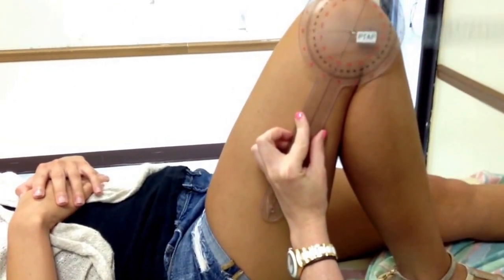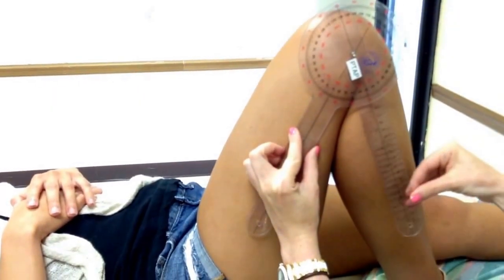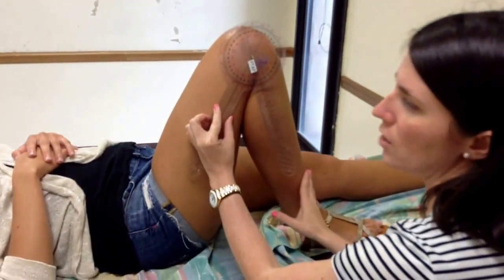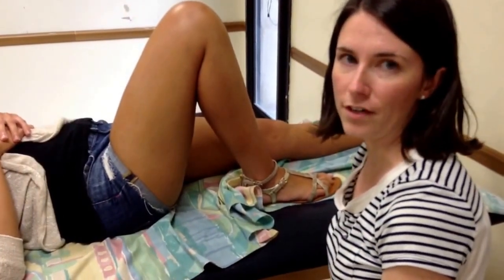Technically she started with full knee extension, then she flexes down and she's got 134 degrees of knee flexion. To document Jessica's knee flexion, it would be recorded as knee flexion 0 to 134.